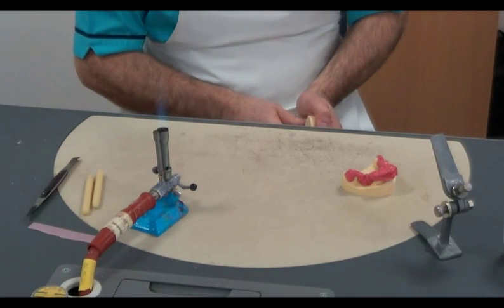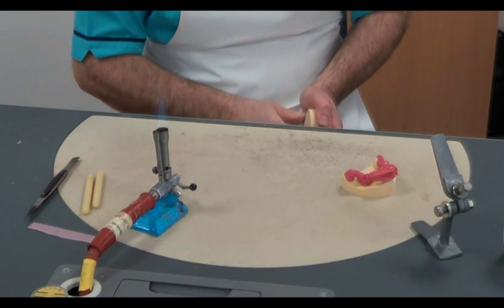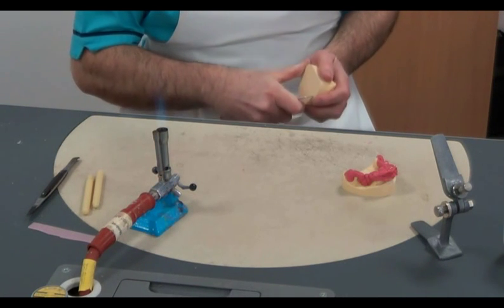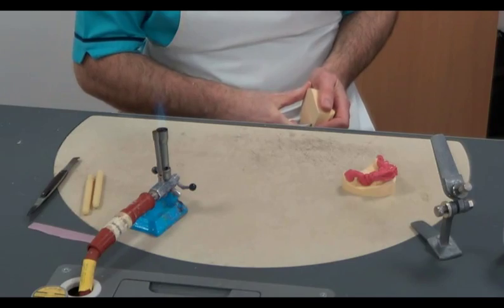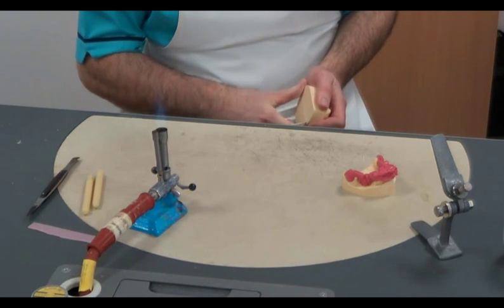To prepare the models for attachment to the hinge articulator, we should first score the base of the models to provide a relocation groove in case the models become separated from the plaster at a later time.